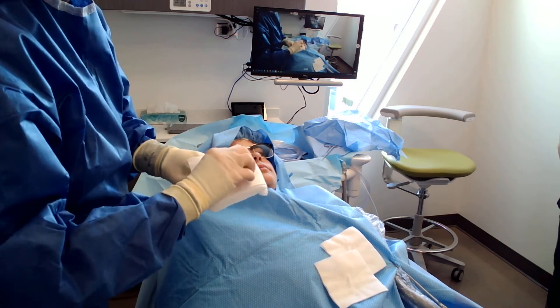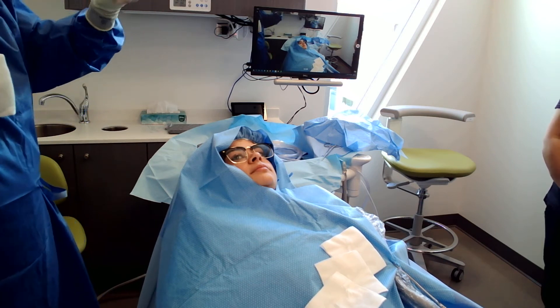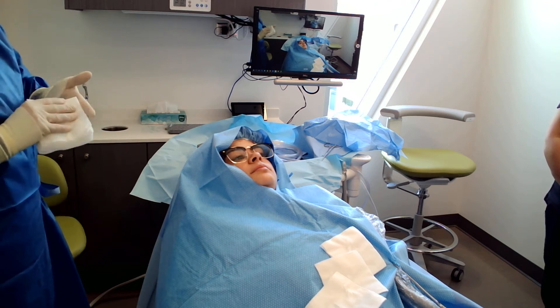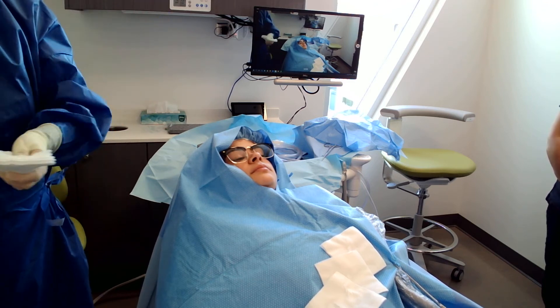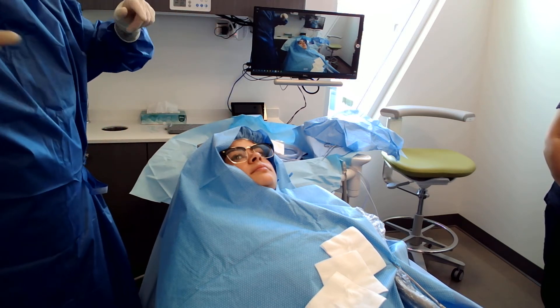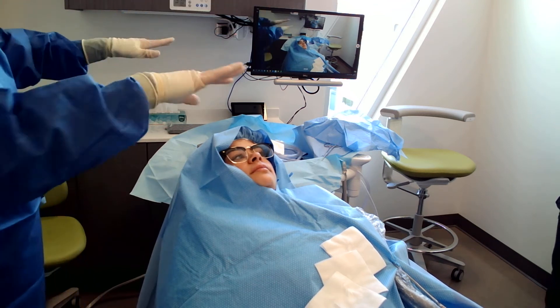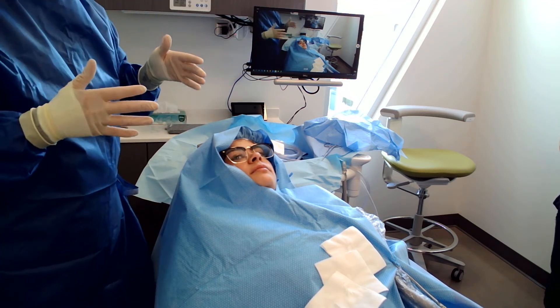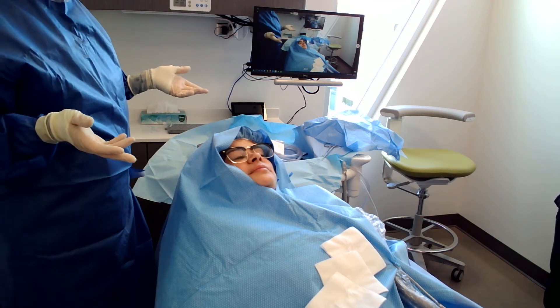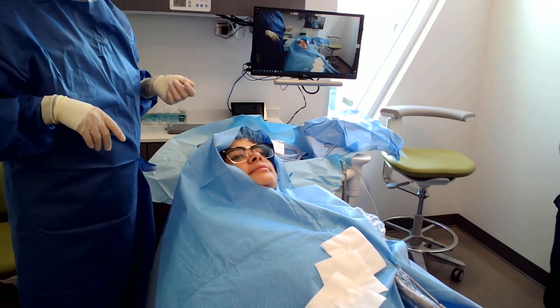I also like to keep some extra 4x4s ready to go so I'm not reaching around. I'll often keep stacks of sterile packages with Nina so if I need more, she just opens them. Anything you think you're going to need — more sutures, another blade, more saline, more gauze — you just have it at the ready. Before I set up one of these procedures, I have grab-and-go bins, like Tupperware bins with everything for a case in one bin, so I'm not running around for individual items.